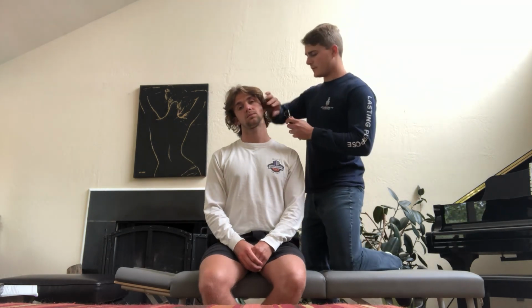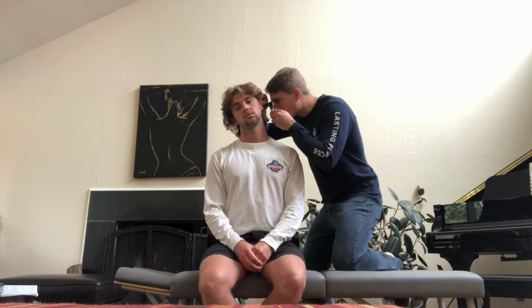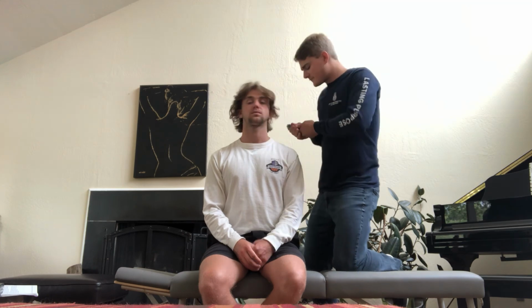And I'm actually going to look in his other ear as well. So left hand, left eye, pull the pinna back. Okay. And that completes the ear exam.